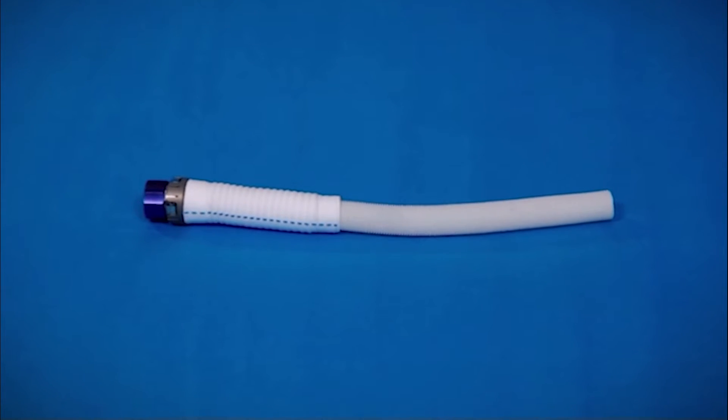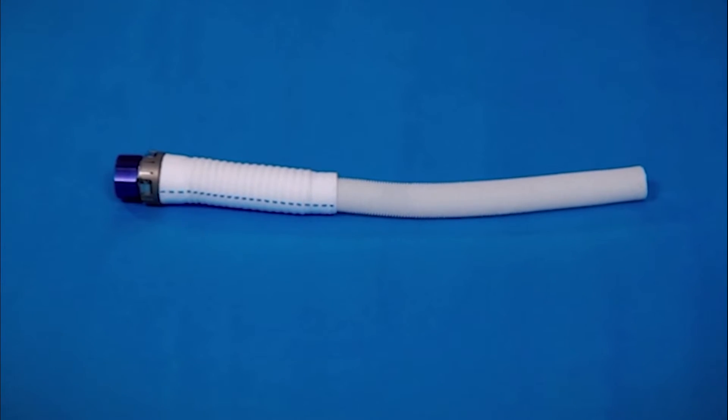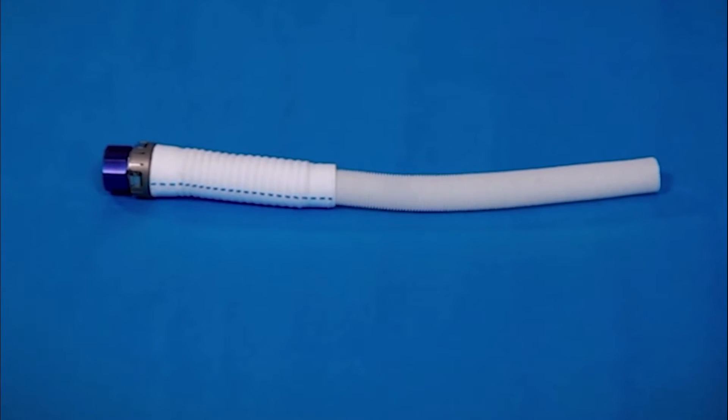The sealed outflow graft eliminates the need for pre-clotting, offering improved convenience and OR time and cost savings.